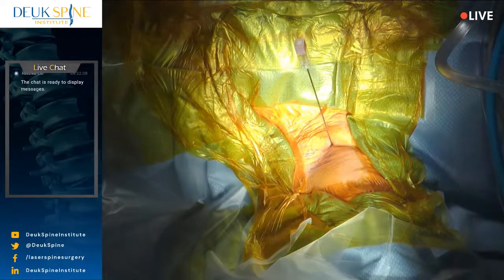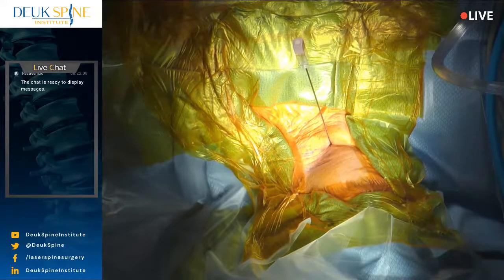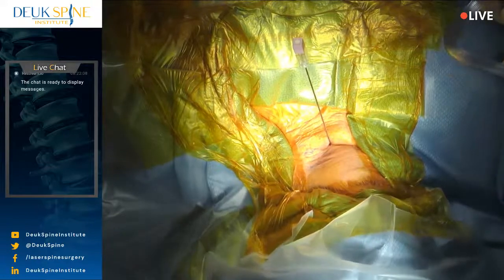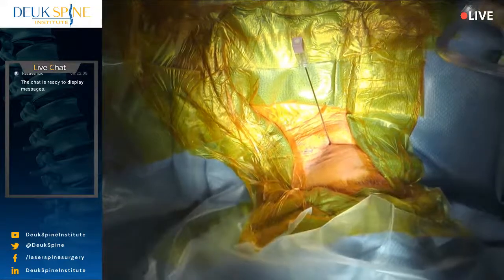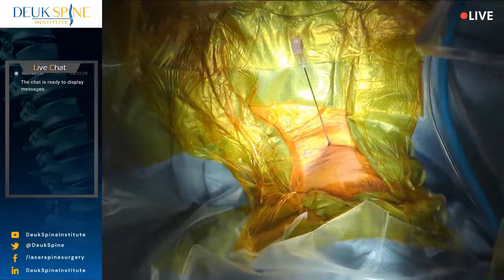Take a shot. And what is that thing there, that wire up at C1, C2? That's one of your monitor wires, doctor? Yeah, it's got to be. Oh, is it one of ours? It's not one of ours, is it? All right. Just see if you can figure it out.